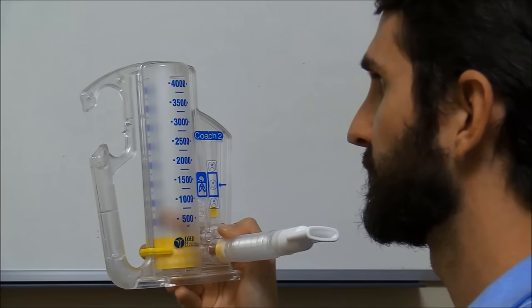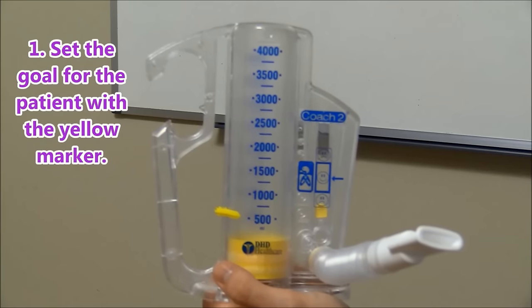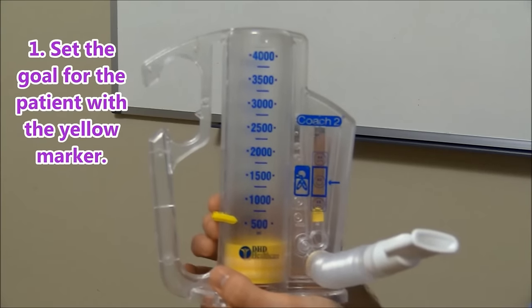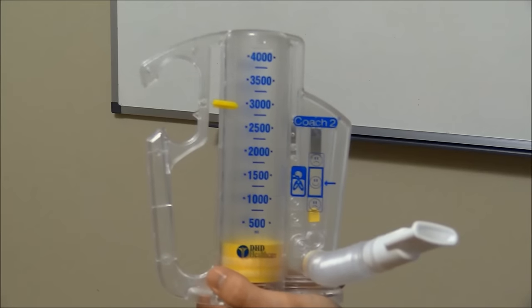Now let's look at the right way to use the incentive spirometer. Okay, first what you want to do is set the goal for the patient with the yellow marker so they know where they need to get whenever using this incentive spirometer.